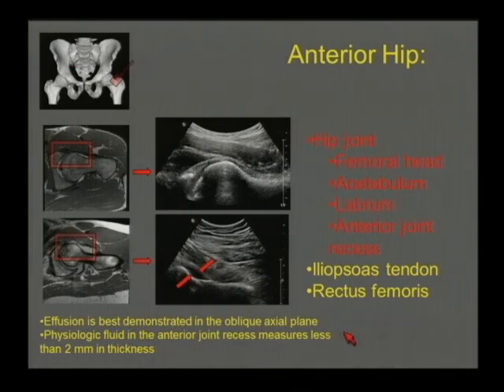In an adult, it's a little bit more challenging to tell. Often at this kind of depth, it can be difficult in some cases to actually distinguish between fluid, synovitis, and the capsule itself. So thickening more than about 7 millimeters or significant asymmetry compared to the opposite side, more than a millimeter, is a sign that we'll sometimes use. So important to be aware of that pitfall, particularly in more obese patients. Getting adequate penetration to look at the anterior joint recess can be a little bit challenging.